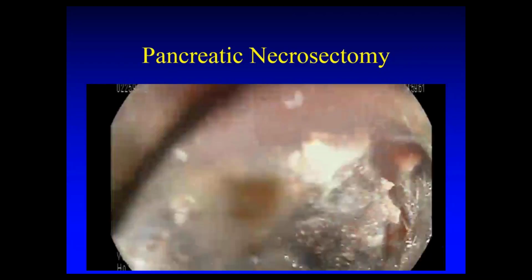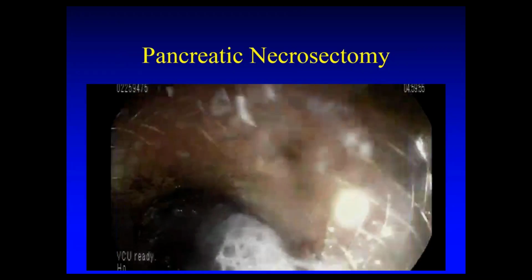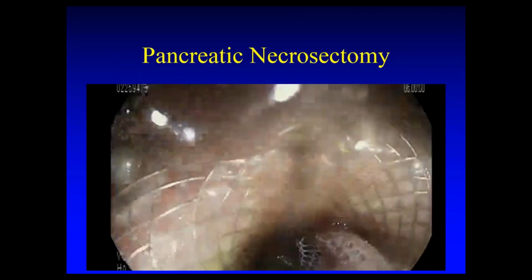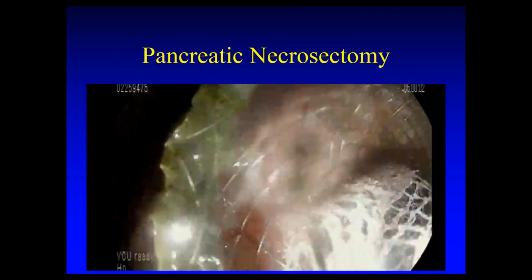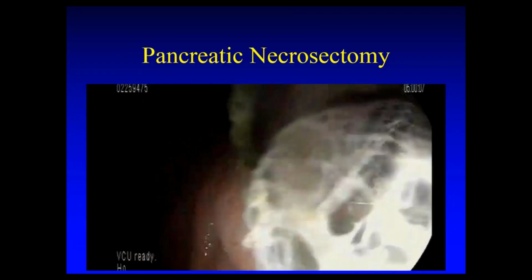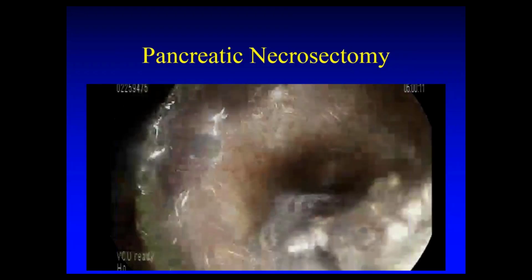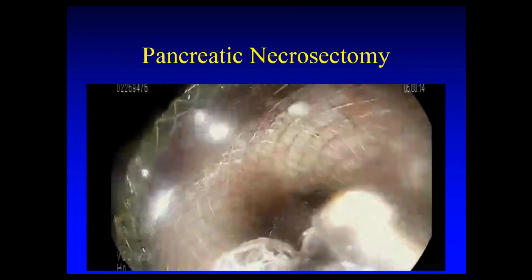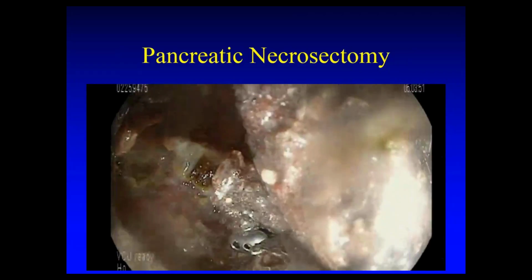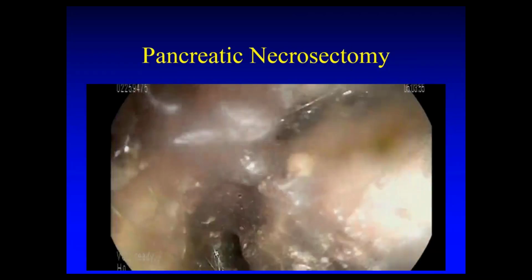And once the cavity is resolved or cleaned out, you can take out the stent and the hole closes up right away, and there's no need to close up the opening with any suturing device or anything like that. So this patient did extremely well. The necrotic cavity resolved and has been doing well during our follow-up.